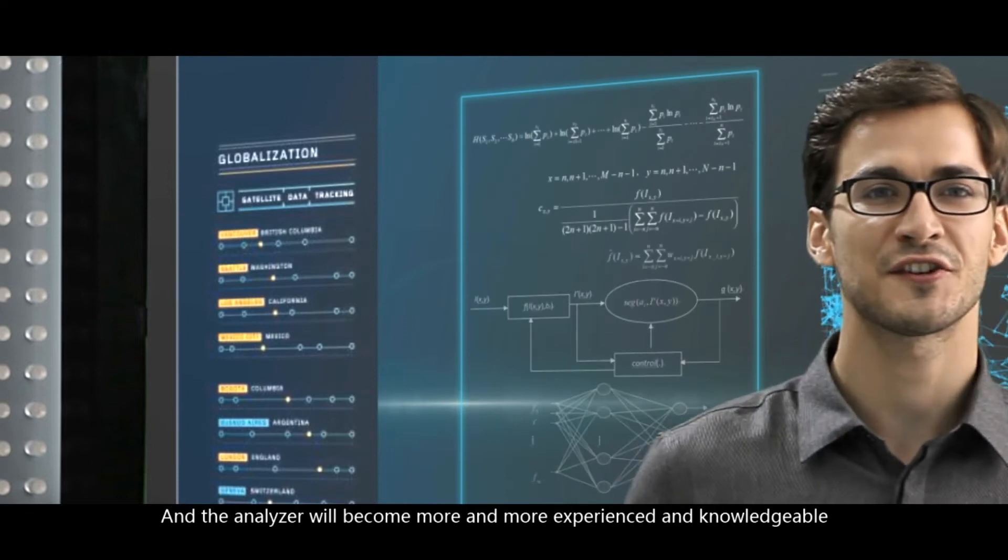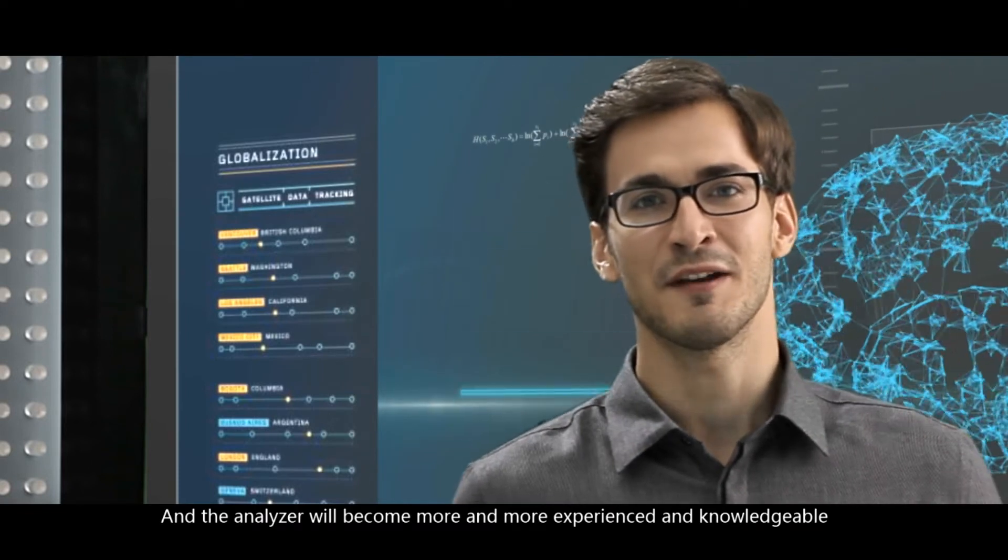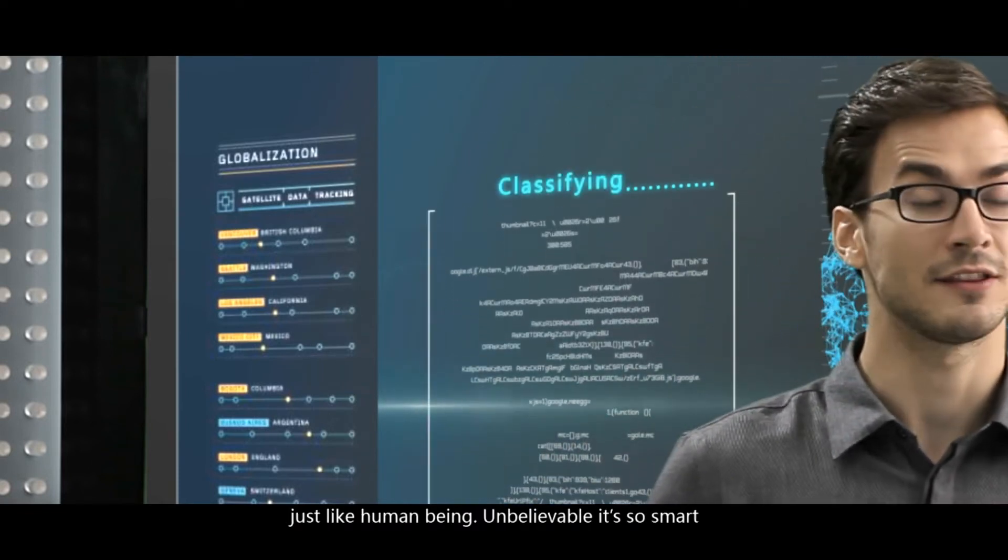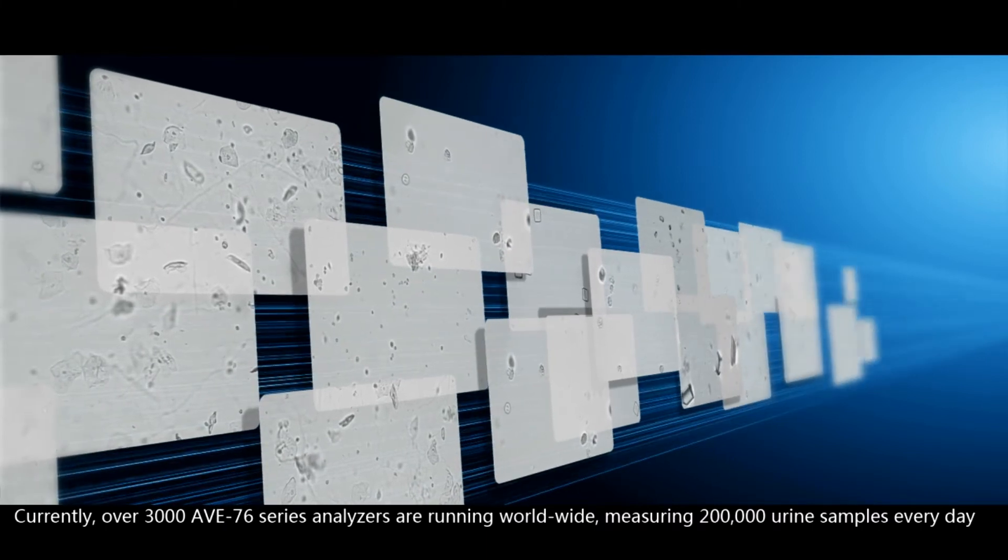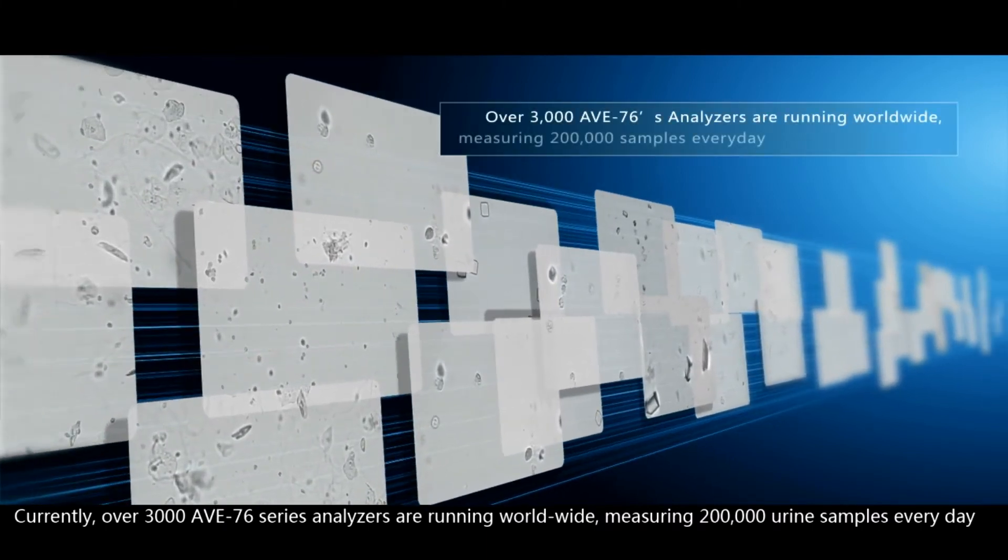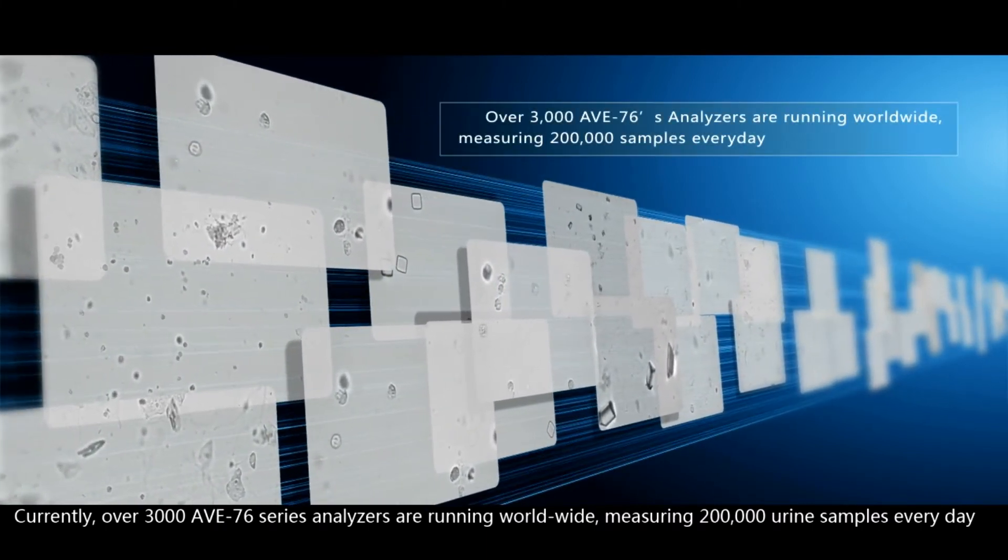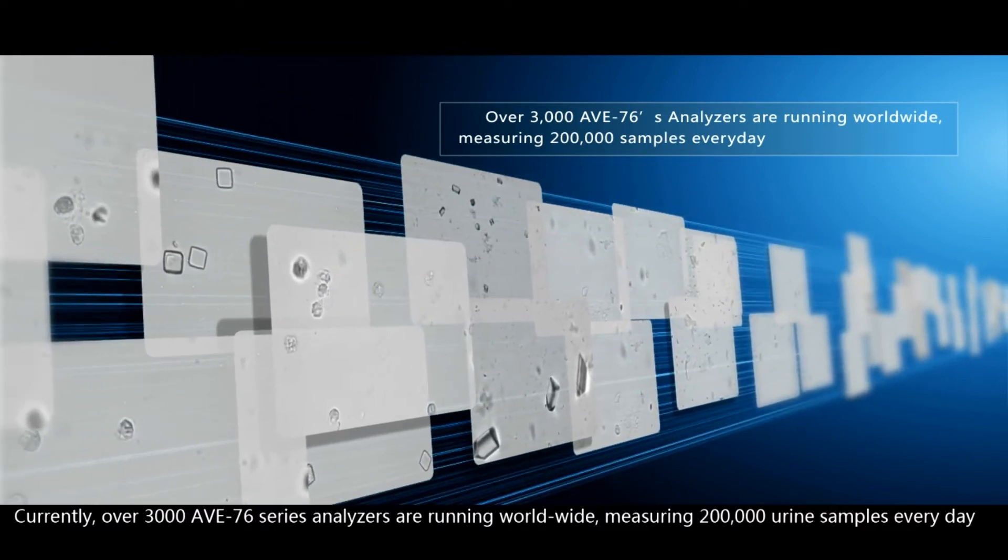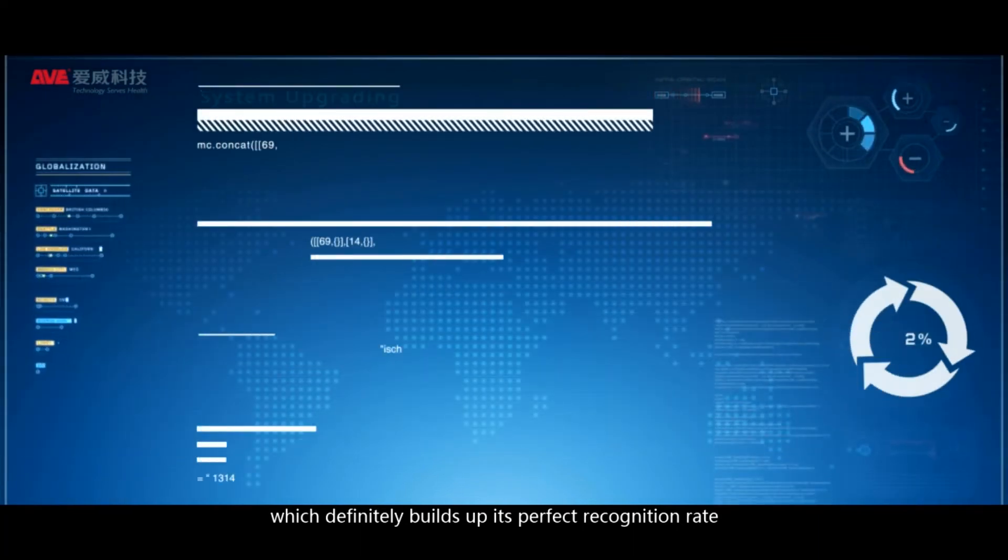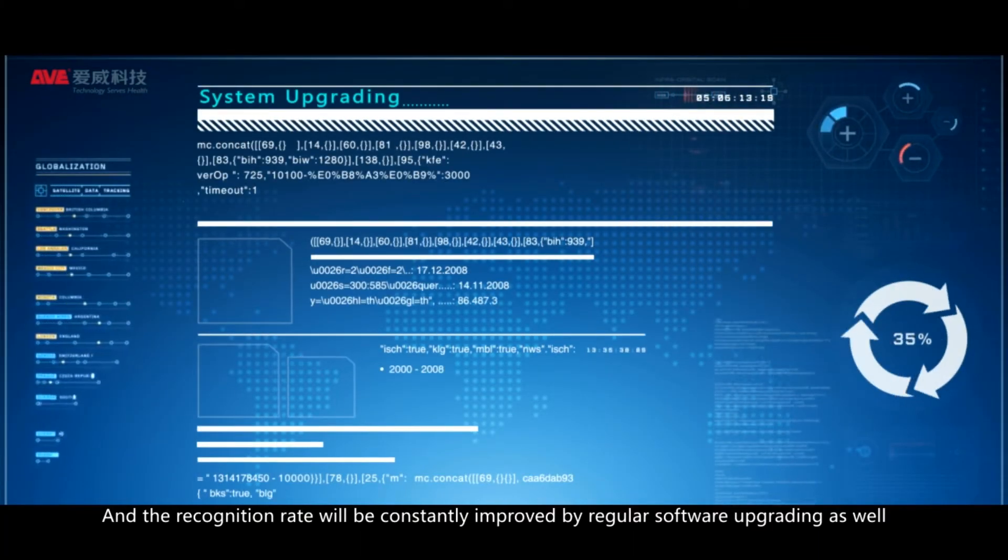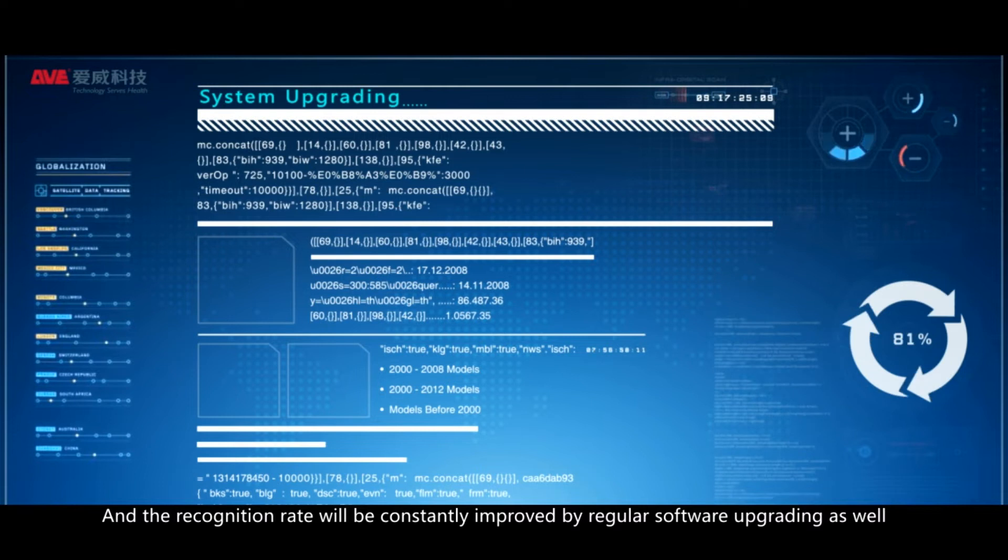And the analyzer will become more and more experienced and knowledgeable, just like a human being. Unbelievable! It's so smart! Over 3,000 AVE-76 series analyzers are running worldwide, measuring 200,000 urine samples every day, which definitely builds up its perfect recognition rate. And the recognition rate will be constantly improved by regular software upgrading as well.